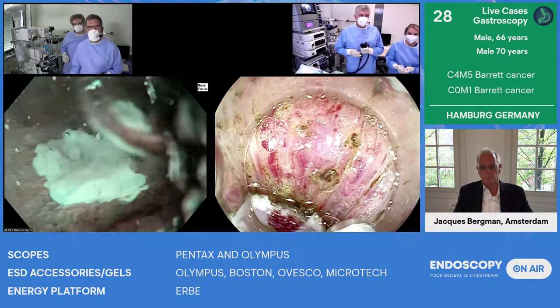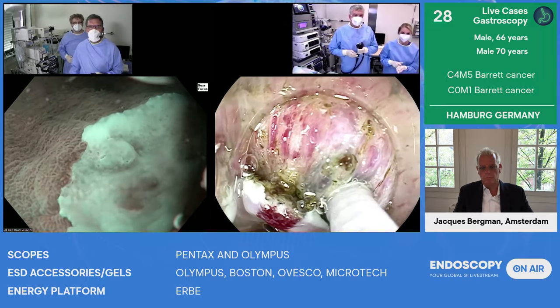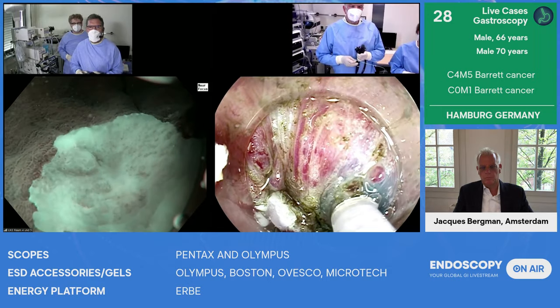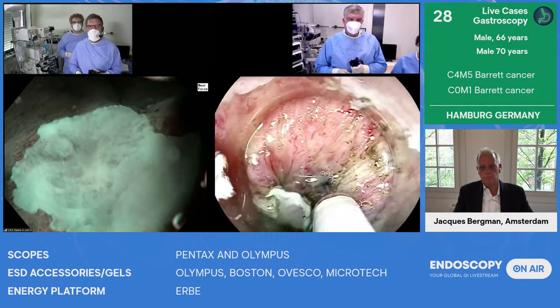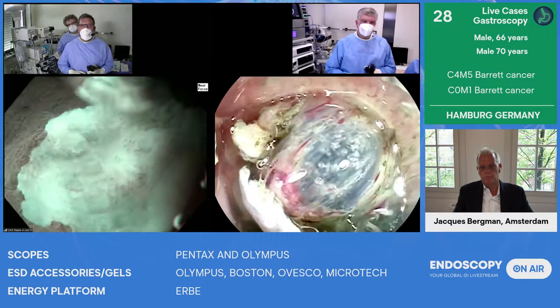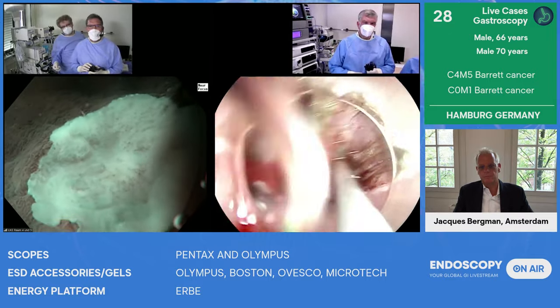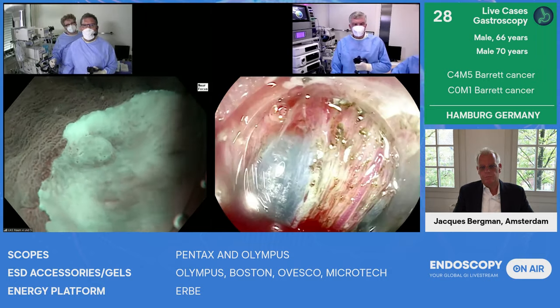Sandra, who helps me, will inject. It comes cold and it hardens. Spritzen. Stop. And then it stays there for quite a while. It makes your life easier. Okay. Good. Nice. So, okay, knife. So this is what we wanted to show.